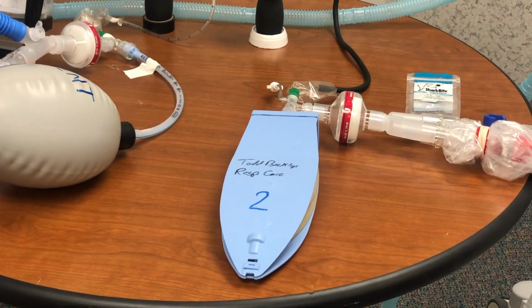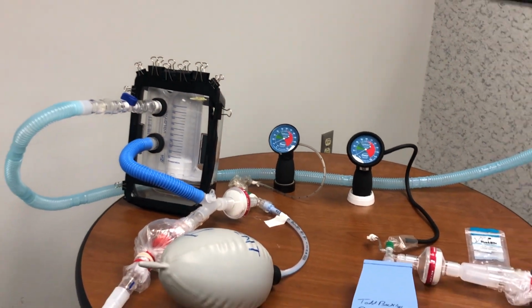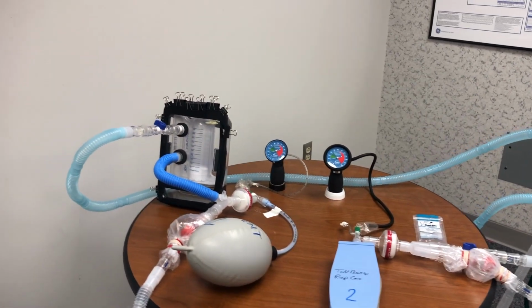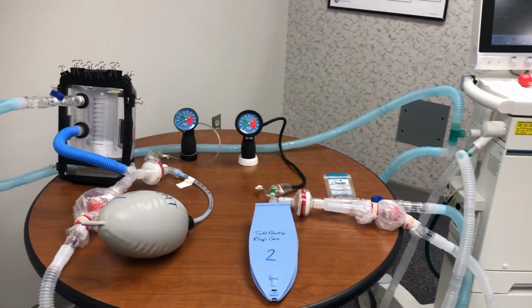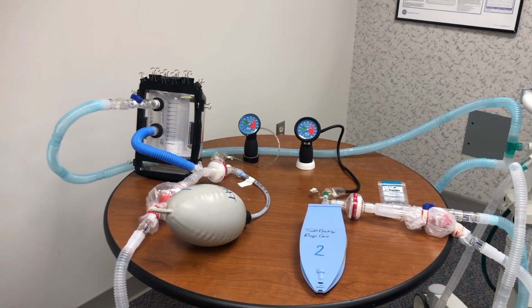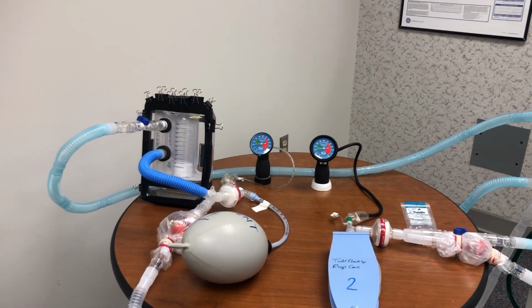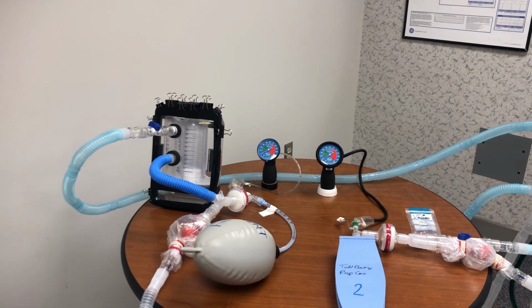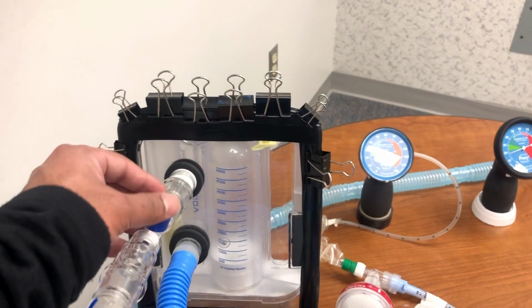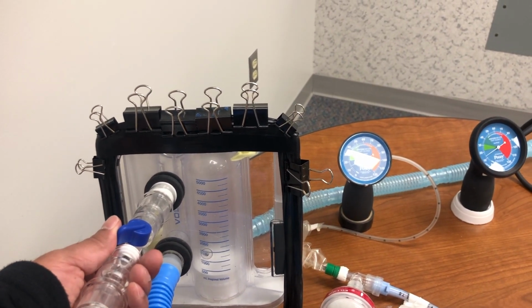Of course, we are not measuring the volume, but since the pressure and compliance have not changed, the volume has to be the same. And we can of course add this spirometer again in this circuit too. We can add it in any circuit basically to measure those volumes. So see, by changing the volumes or pressure on one patient, nothing changed on the other patient. So again, if you want to change it to 500 again, we can just change it depending on what the patient needs.